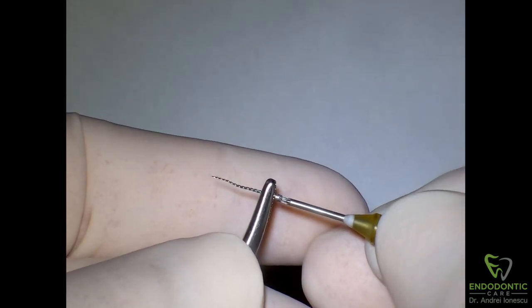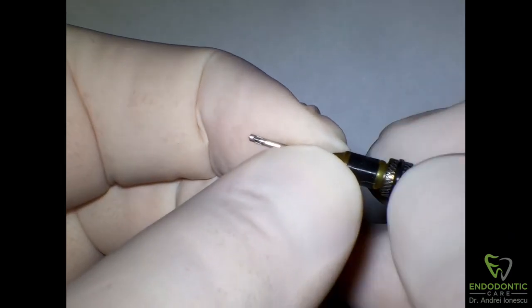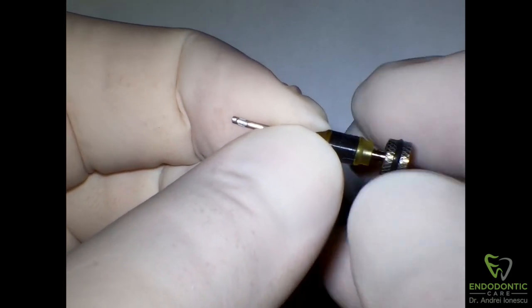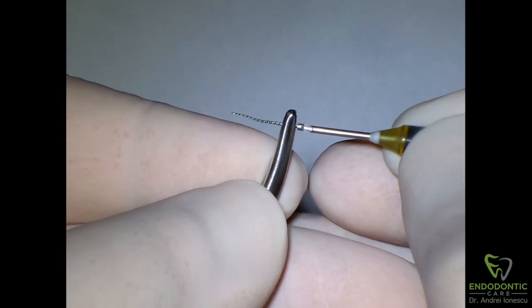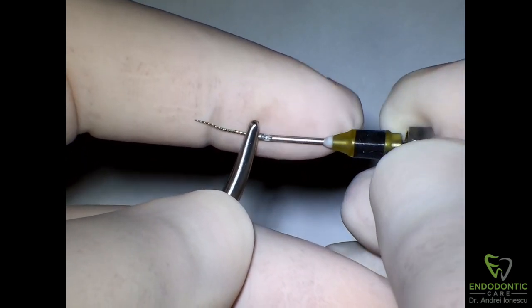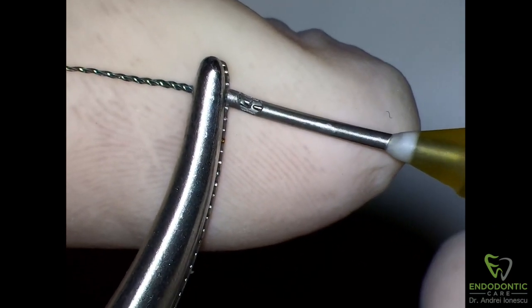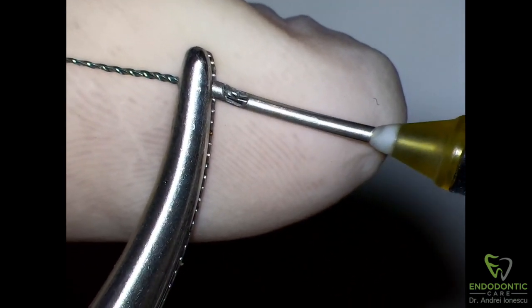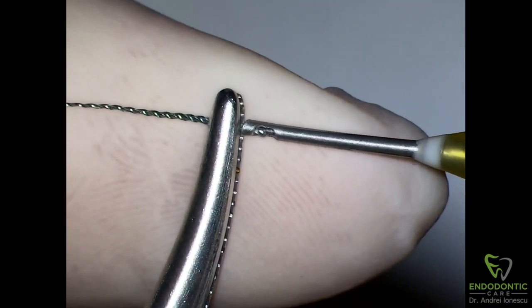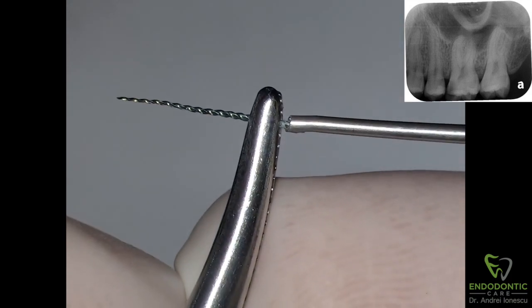The first thing I would suggest is to try — get another file, you can cut it — and then try to see which IRS fits it perfectly. In my case it was the black one. You just kind of try it in your hand, and you can see if you can gauge about 2mm of the file, then you turn the inner portion in a counter-clockwise direction. You'll see how it can get a really tight grip on the file, and you continue turning counter-clockwise and it should come out. So let's see how it went.